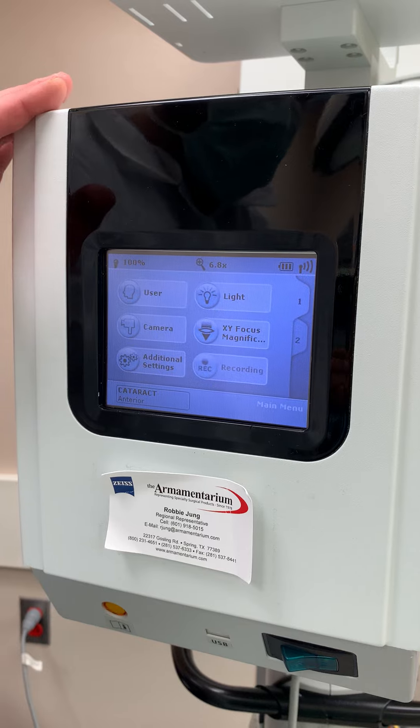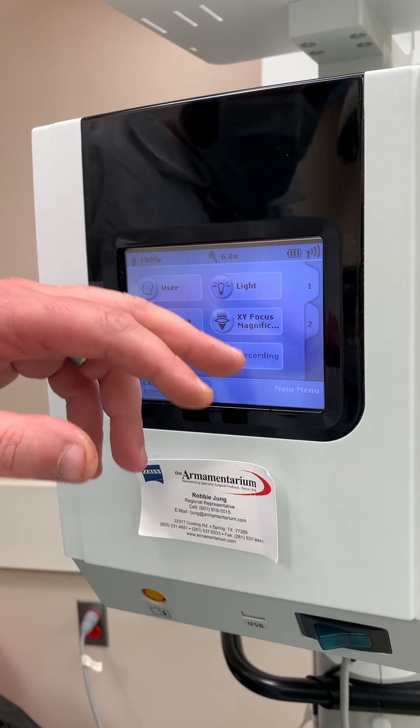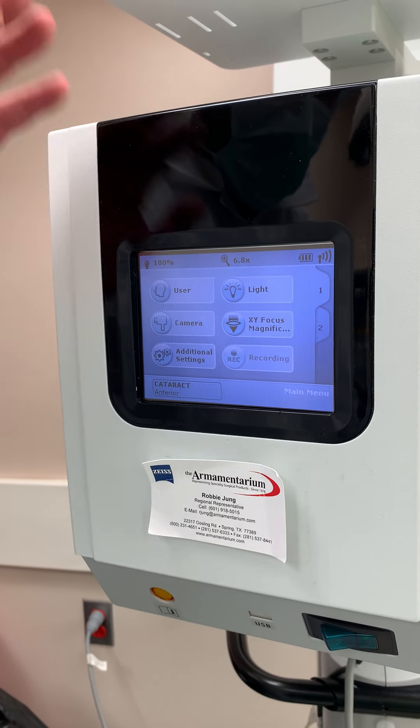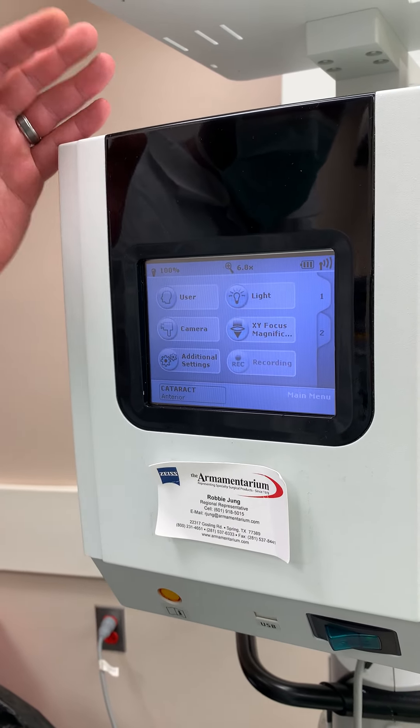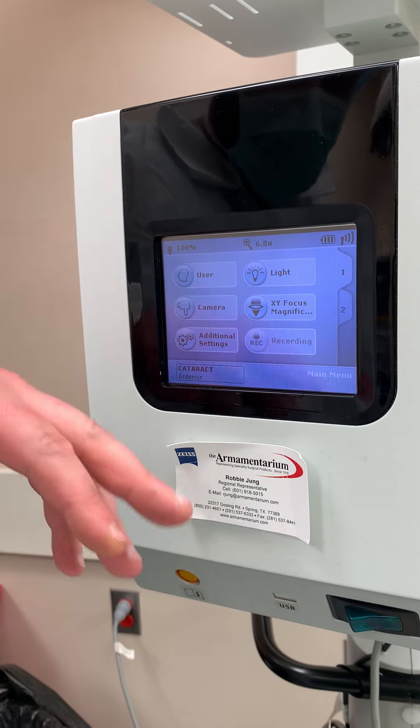With this scope, you will sometimes get errors when it first loads up. Just exit it. If the errors continue, shut the scope off, turn it back on — they should go away. If not, call Prescott's and we'll be out here to fix it.